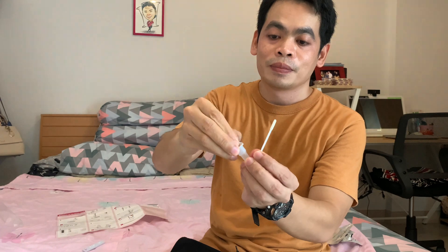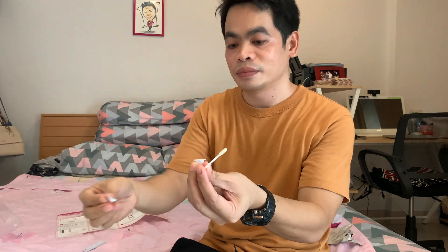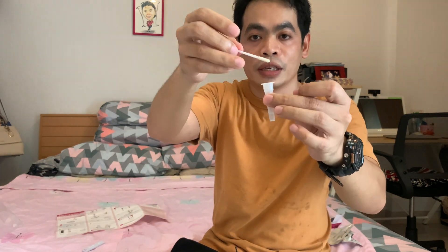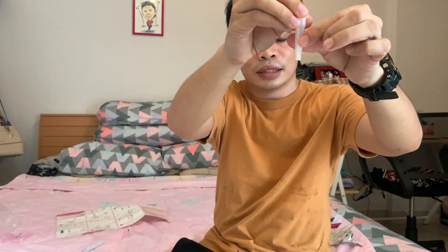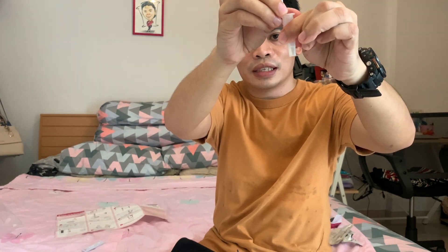It says open this — here we go. Put this one here in the solution. Squeeze, squeeze, squeeze — and then slowly take out this one while squeezing.